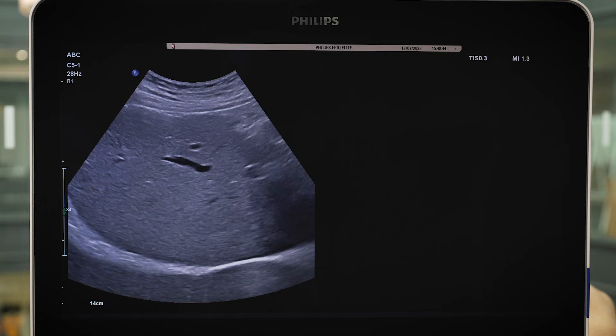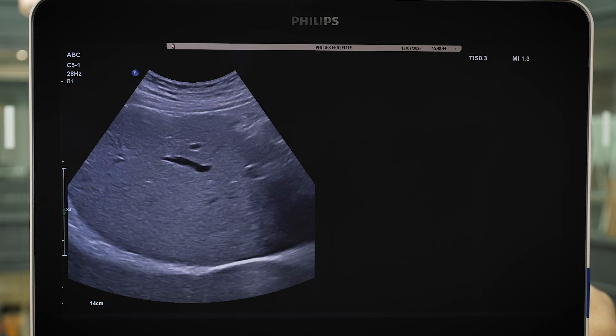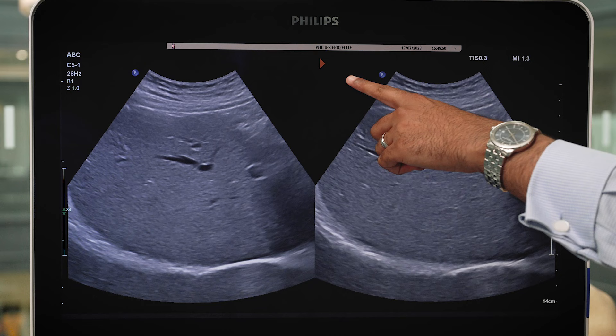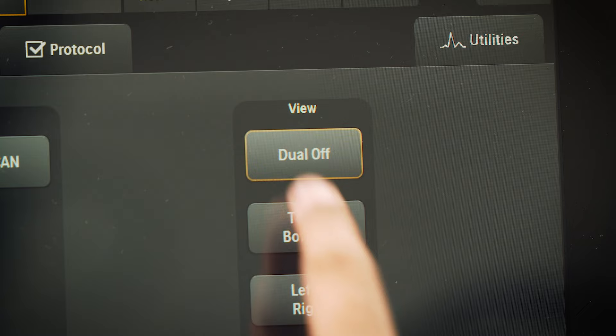Dual is located on the control panel. Press dual to split the screen and dual again to flip between the sides. The visual orange arrow demonstrates the live scanning screen. When you would like to return to a single image, press dual off on the touch screen or press the 2D button in the middle of the control panel.